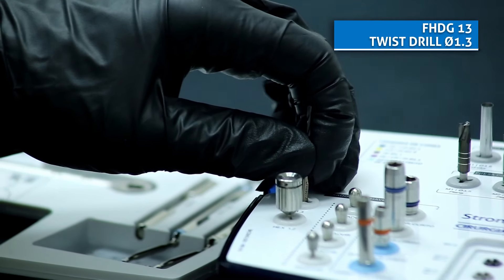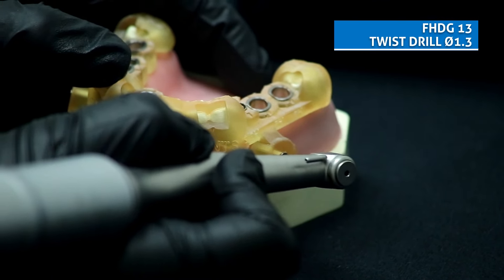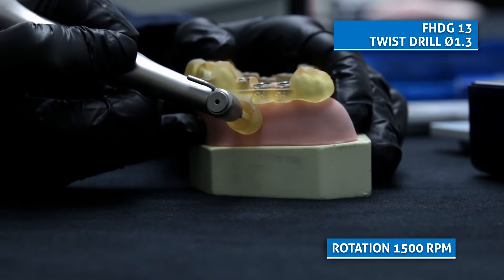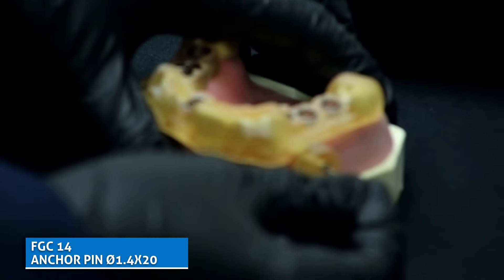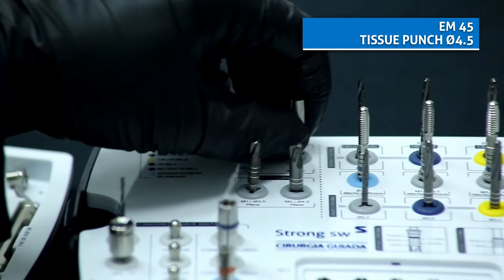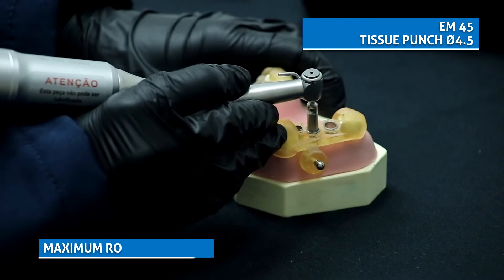With the guide already well adapted in the patient's mouth, fix the guide with the anchor pin. After it is already positioned inside the sleeve, start the rotation. The anchor pin present in the kit must be installed under pressure in the fixing sleeve. Select the tissue punch with a diameter of 4.5 to make the next perforations easier.